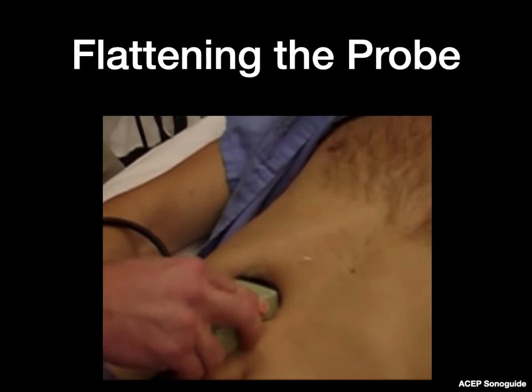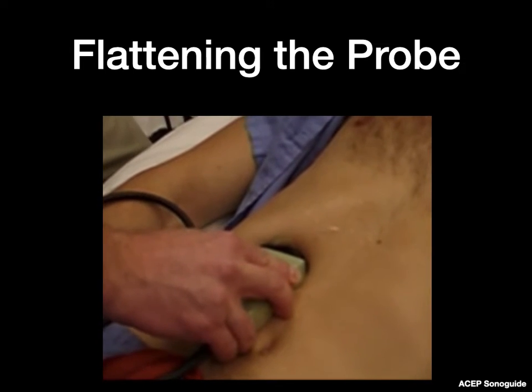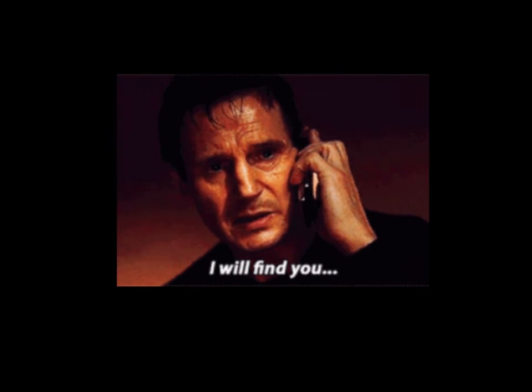In reality, a combination of all of these approaches is generally used when someone is looking for the gallbladder. Even with all of these different techniques, it can be elusive. So here are a few tips to improve your technique.